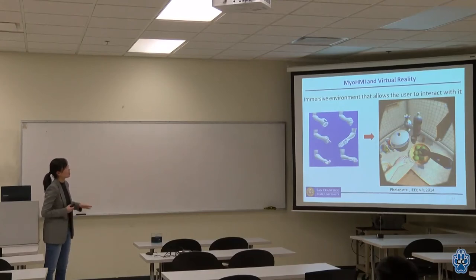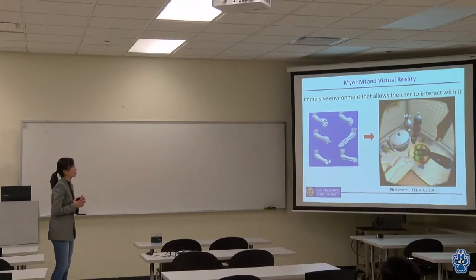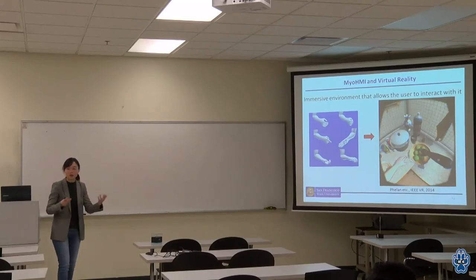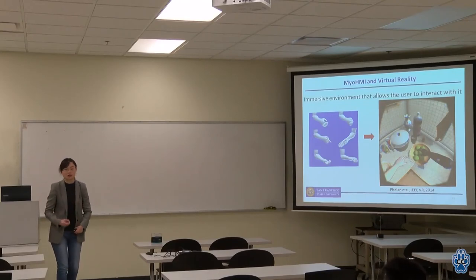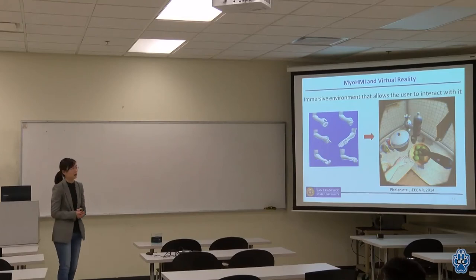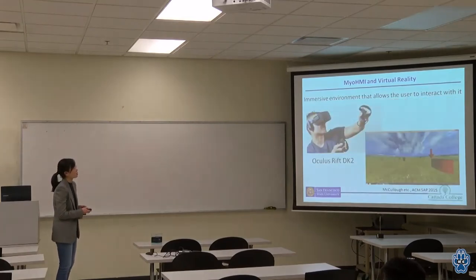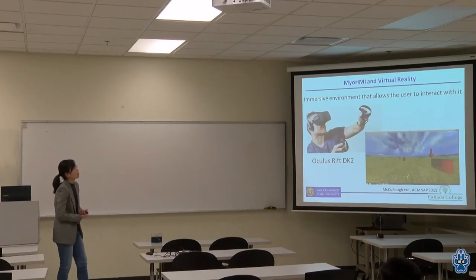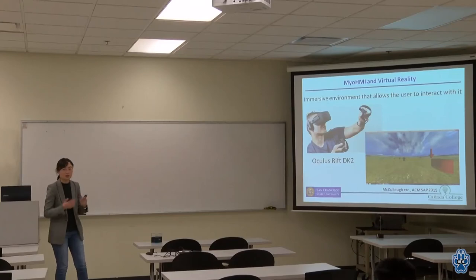Another part of our ongoing project is that we are also developing virtual reality systems, like virtual reality games for, for example, stroke rehabilitation, that can also be interfaced with this neural machine interface. So that's also part of our research. This virtual reality system can give the user an immersive environment that can help the training for rehabilitation, and also even simple entertainment, just for gaming purposes.